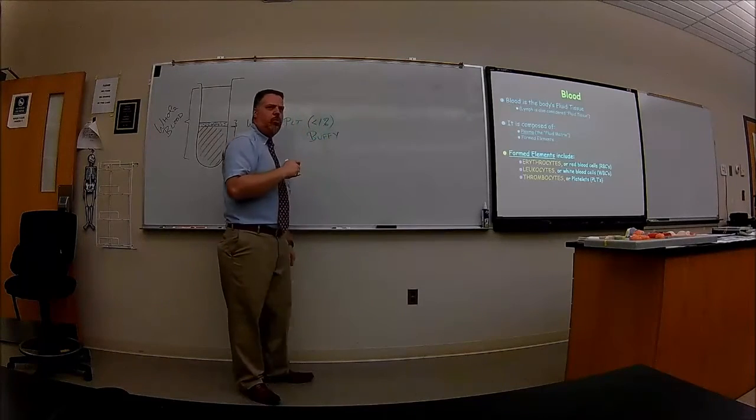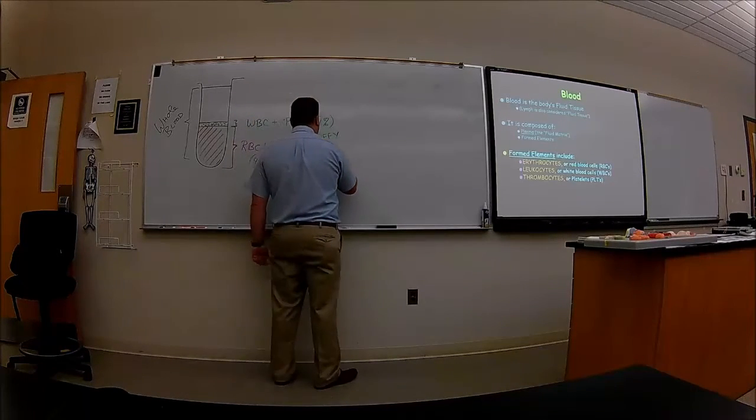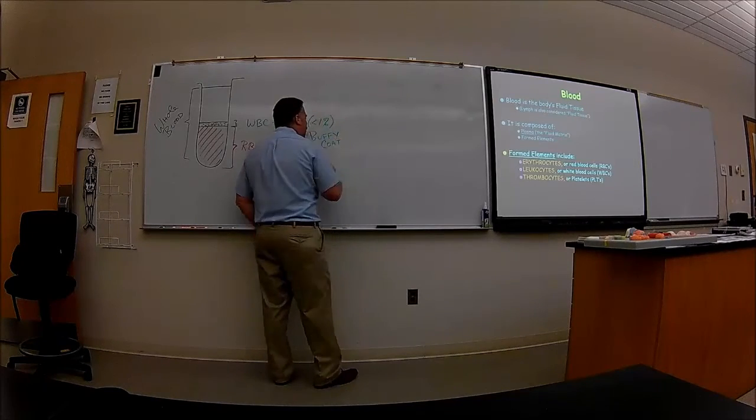Am I telling my age? Do you know who Buffy is? Okay, alright. So we call it a buffy coat or buffy layer.